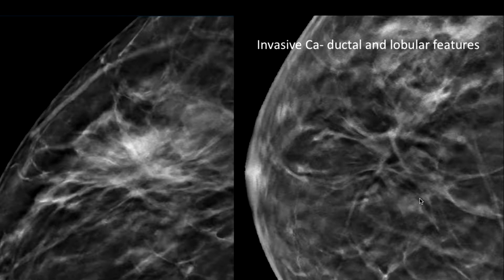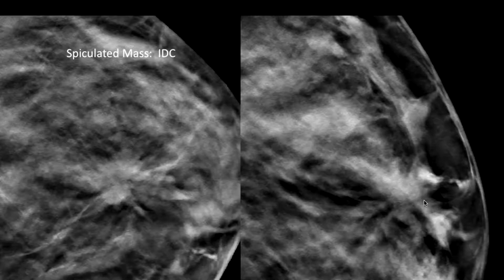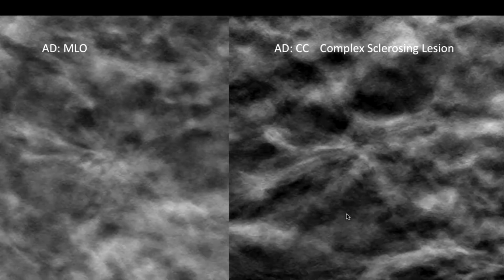And that we can see, and this did not show up on the 2D and only showed up on the tomo slices. A spiculated mass, again, I don't care that it's actually a mass. We're looking out here in the fat, the straight lines in a radiating and spoke wheel fashion out here near the nipple, again, in that location. In contrast, there's no central density.